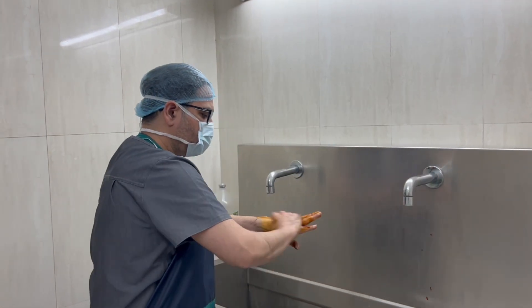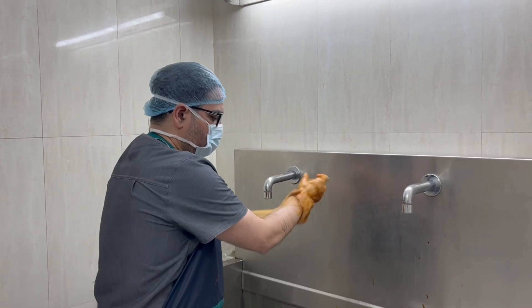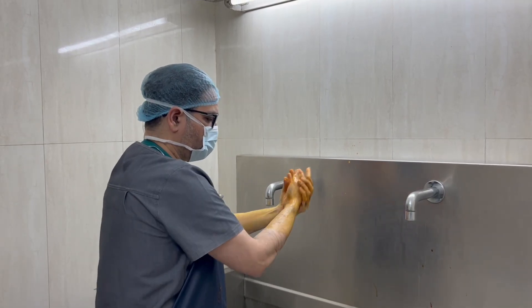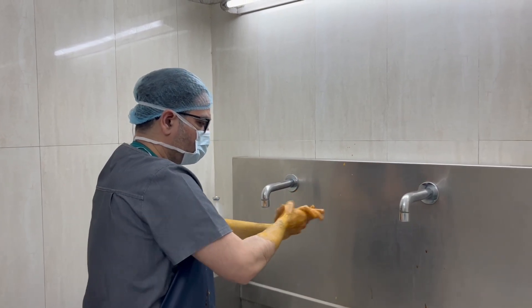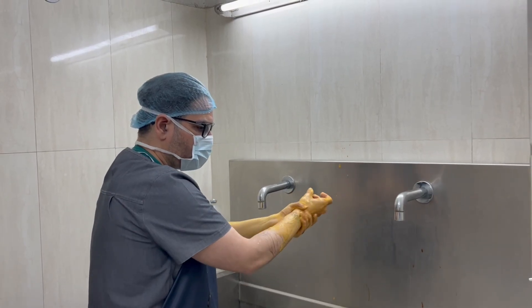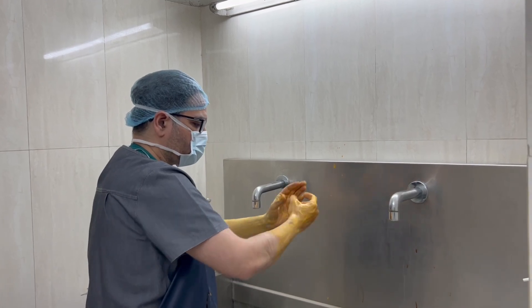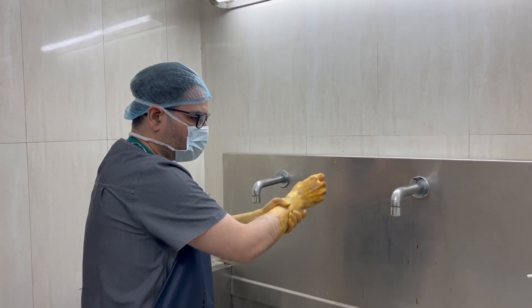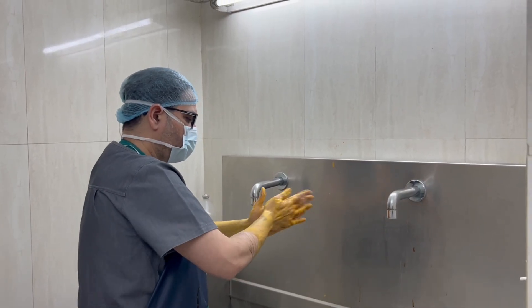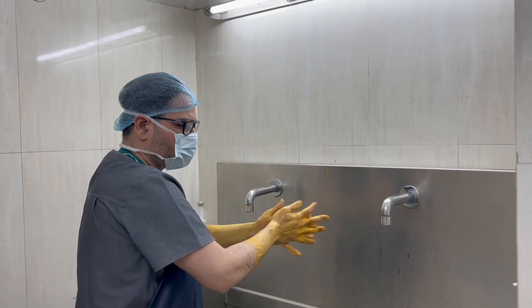We have taken this antibiotic solution and we scrub with it for 10 minutes. This scrub is very important to prevent infection.